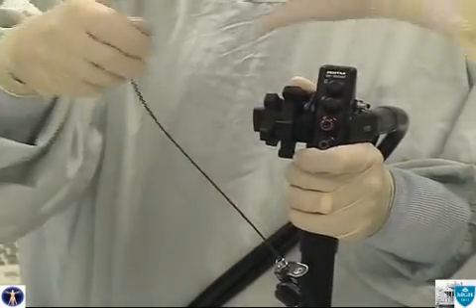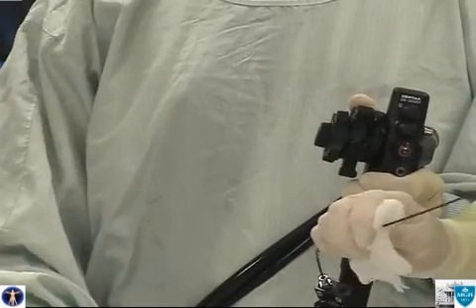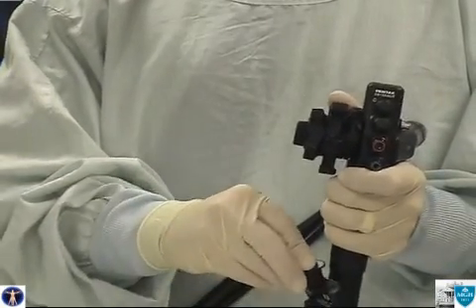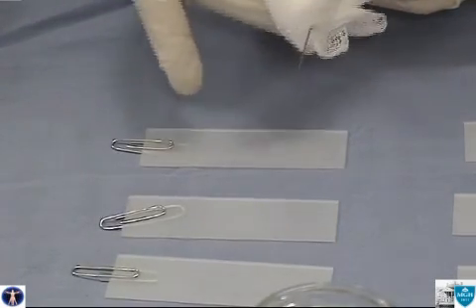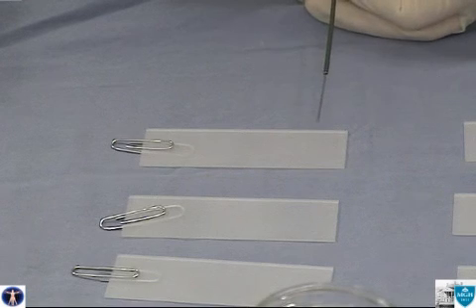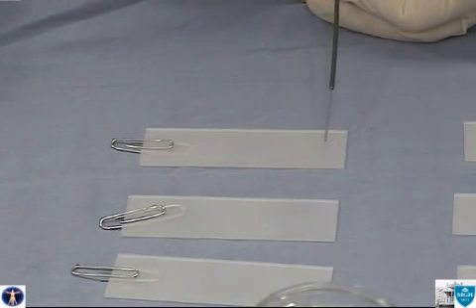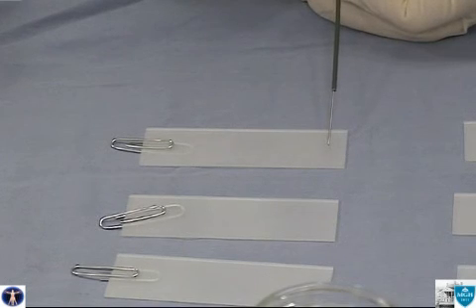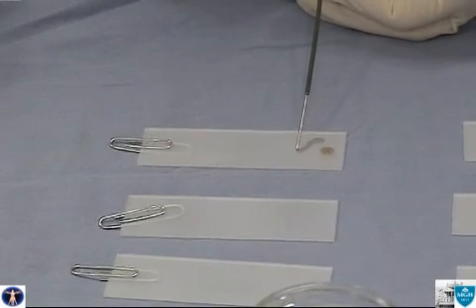Once sufficient material has been aspirated, the 22-gauge needle is removed from the echoendoscope and the diagnostic material is placed on a glass slide. Before doing this, the needle is cleaned of gastric contents. The metal stylet is used to push the cytologic material through the needle and onto the glass slide.